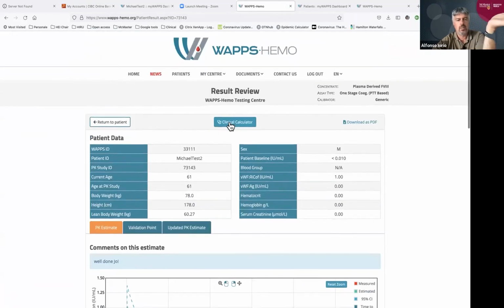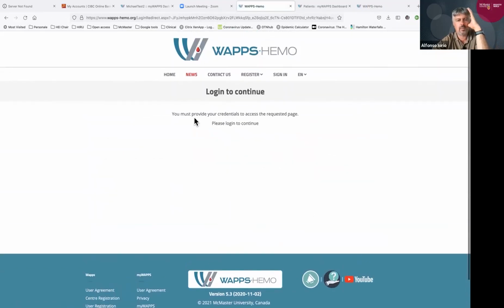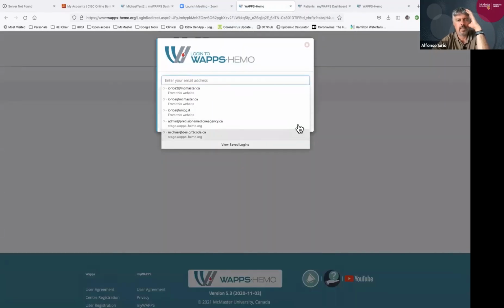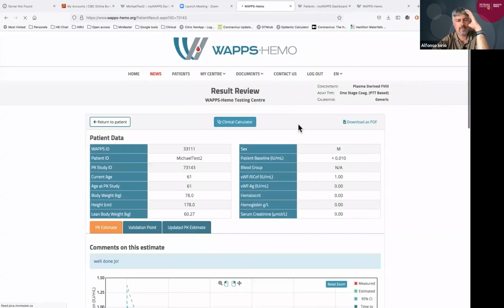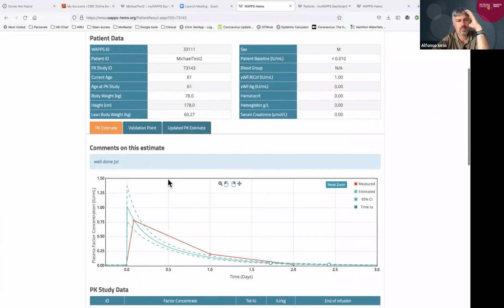You can go in the clinical calculator. We have gone there. You can create a treatment plan. That one, you can again, sorry, now I logged out for some reason. You can create a PDF of a treatment plan and hand it over to the patient.